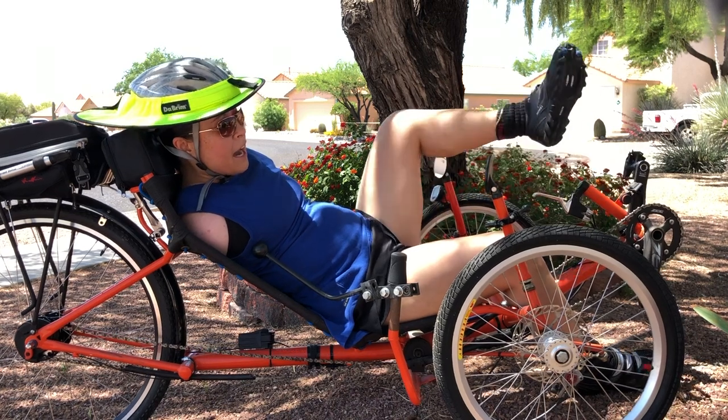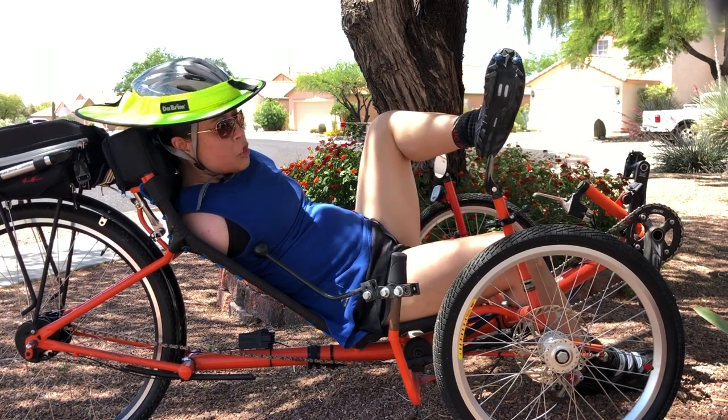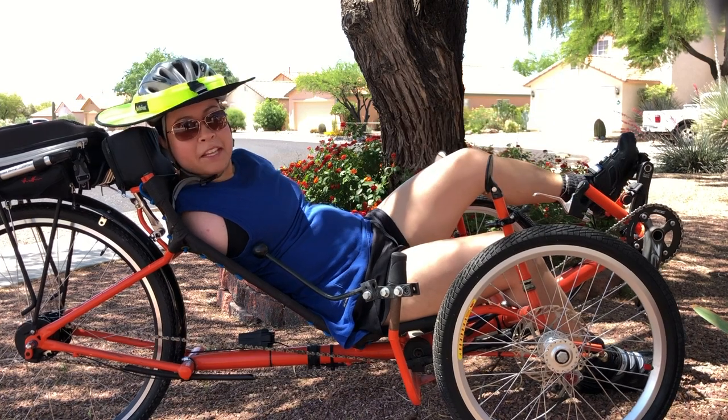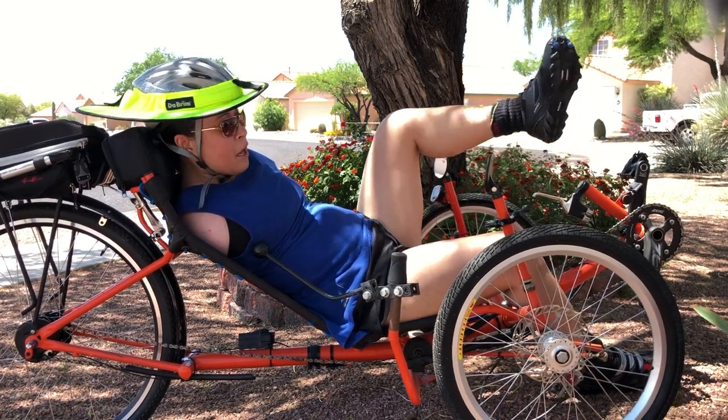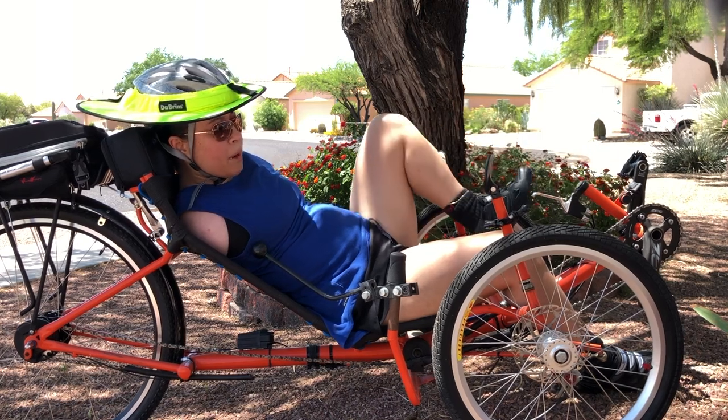To start with, I do not use clips on my cycling shoes, because if I clip my feet into the pedals, it eliminates access to my feet — which I need for controlling my gears, for example, or my brake.